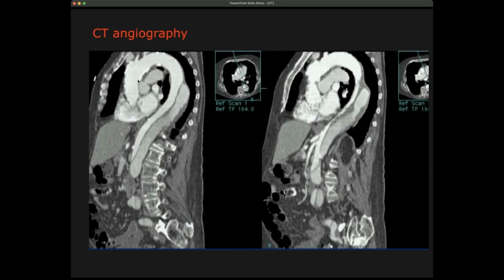looking here at the aorta, you see these very bright spots at the site of the aorta. You see at several points these very bright spots. And the brightness of these spots is similar to the bone. So this is actually calcification. This is a patient that had a lot of atherosclerosis, which is then calcified, and obviously calcification, calcium, will be very bright on X-ray imaging, and so you really can look at calcification of vessels with a CT scan, for example.